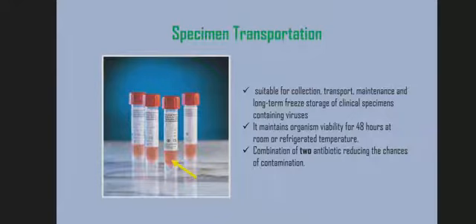Other viral transport media have colorless fluid, but it should not be utilized because it may cause a false negative result, and if the colorless fluid transport media is used, the test should be conducted immediately. Unlike the VTM with pink fluid, it could be tested for days, only if it is stored in refrigerator temperature. Viral transport medium comes with a 2-antibiotic combination for reducing the chances of contamination, and it contains fetal bovine serum and a cryoprotectant which helps the sample to prolong storage.